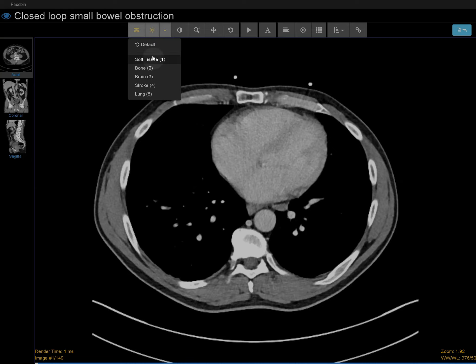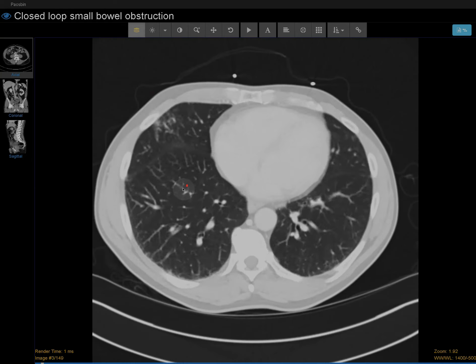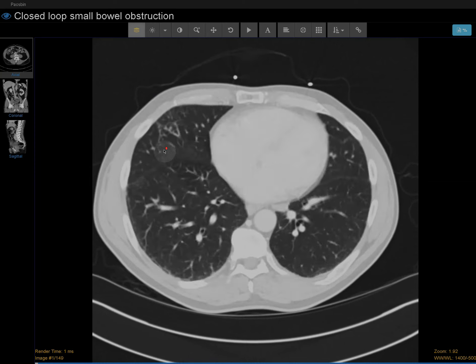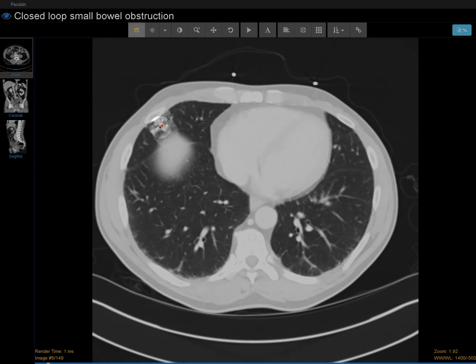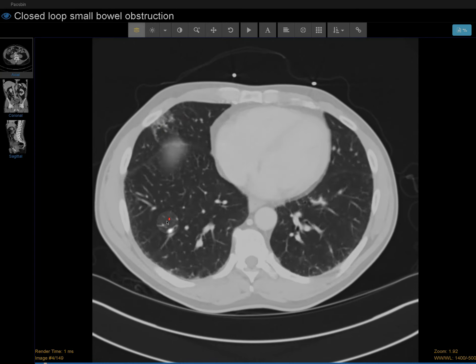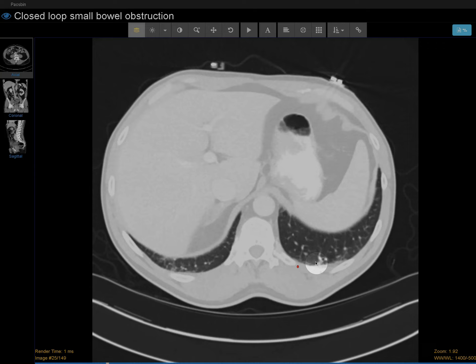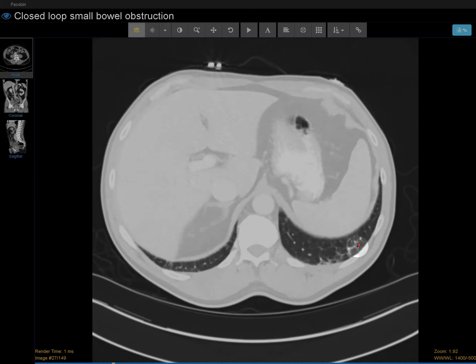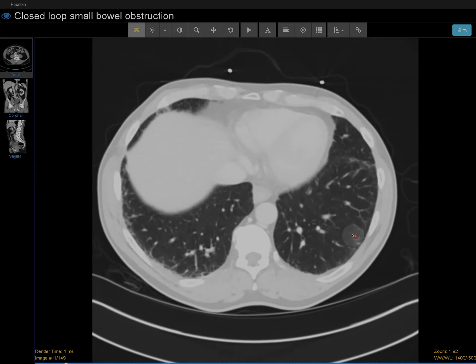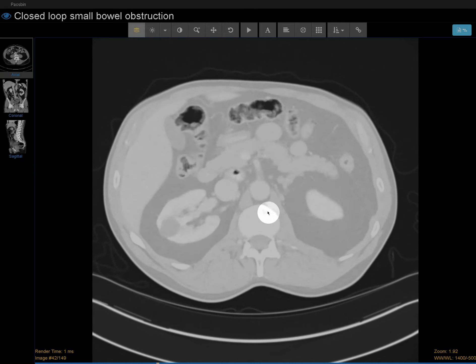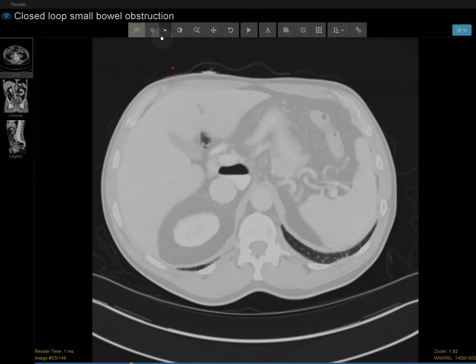Let's quickly scroll down to see if anything catches our eyes in the lung bases. There's some opacity here, some nodular densities in the bases. I didn't see a large consolidation, pleural effusion, or pneumothorax.